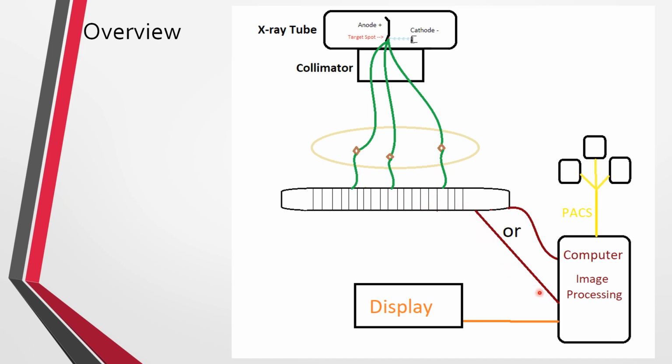That is then carried via a cable or another type of electromagnetic wave, Wi-Fi, which is 2.4 gigahertz typically, and then that can be displayed and sent to other computers, and we'll learn about all those processes next.